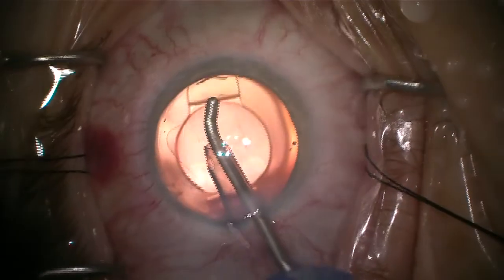Now a nice view, a good deep chamber — dimple, press the button, release, and see the iStent inject in beautiful position. Two o'clock hours away with a nice reflux of blood, indicating good placement and good connection into the venous system.